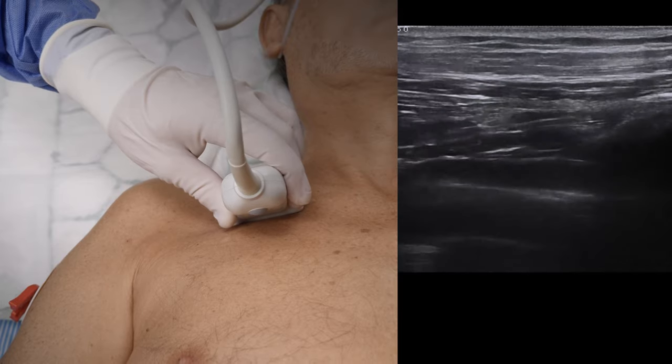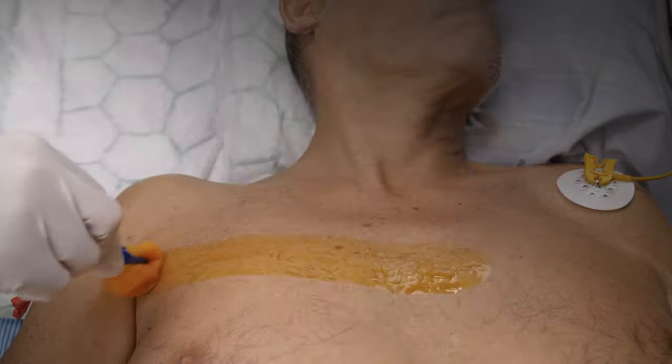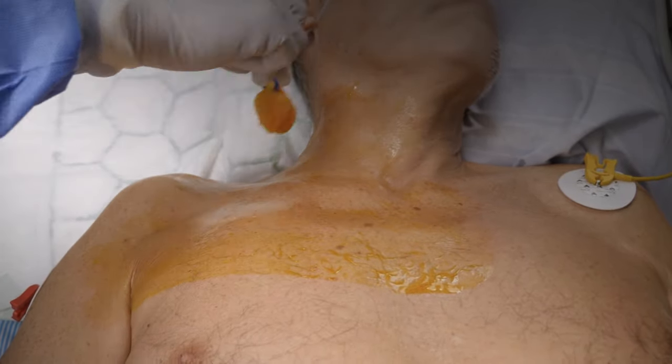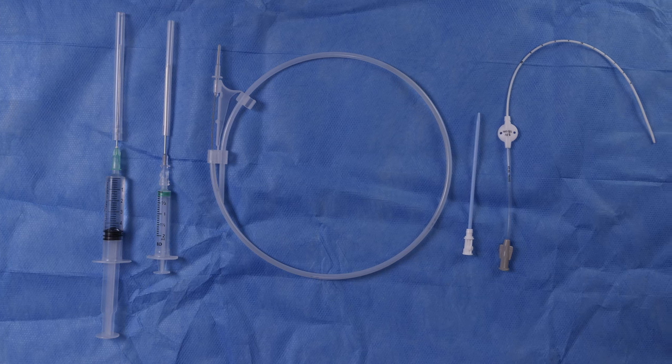Note that the vein might actually pulsate due to the proximity to the artery. Prep a wide area, including the clavicle and up on the neck, following your local guidelines. While waiting for the chlorhexidine to dry, prep your tray.